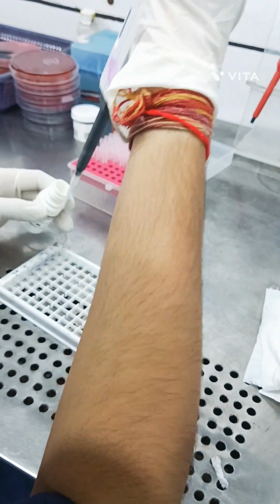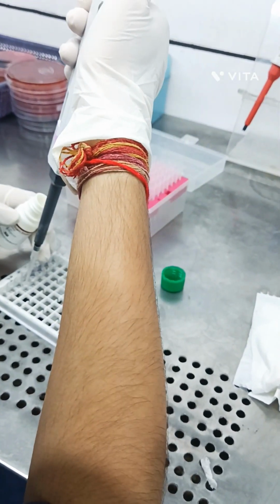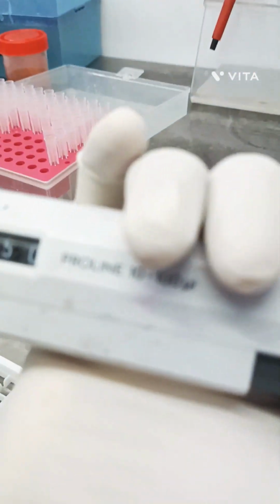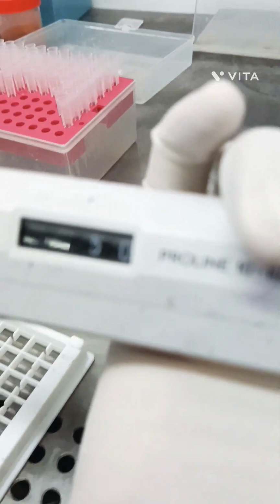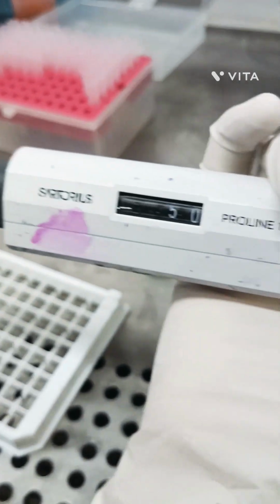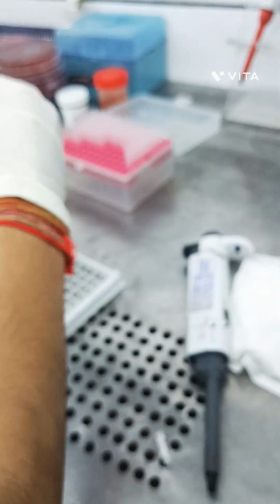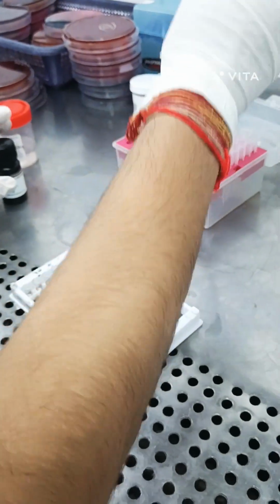So dispense 50 microliter chromogen A and 50 microliter chromogen B solution in each well, including the blank also, tap the plate gently and incubate the plate at 37 for 15 minutes. Important: avoid light.